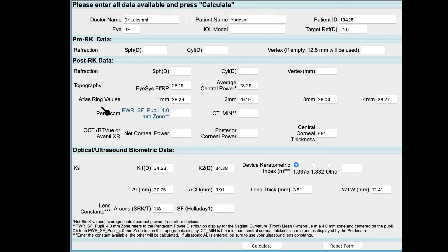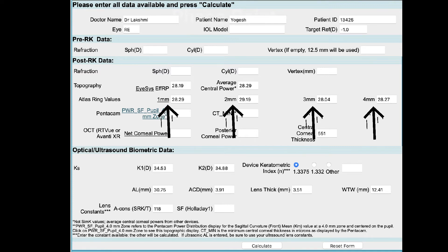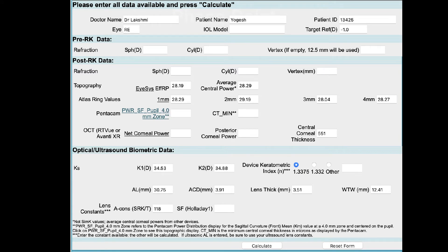Next, we come to topography. The data needed depends on which topographer you are using. If it is an Atlas topographer, it will ask for keratometric readings at the 1, 2, 3, and 4 mm zones. There will be different parameters if you use a Scheimpflug device or a Pentacam, and finally, if you use an OCT-based system.